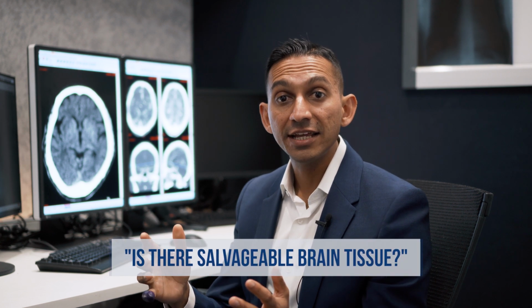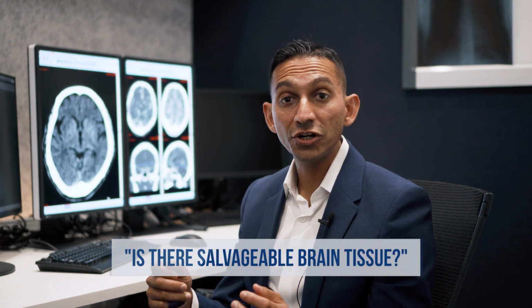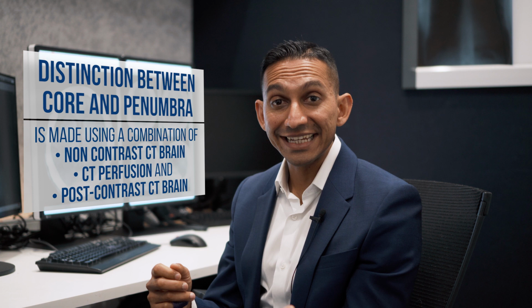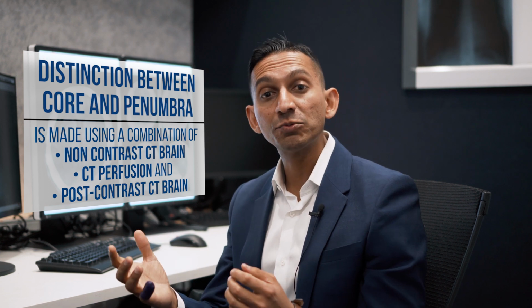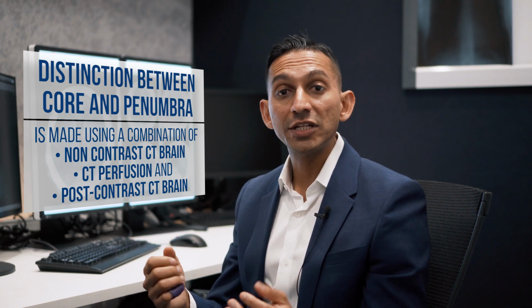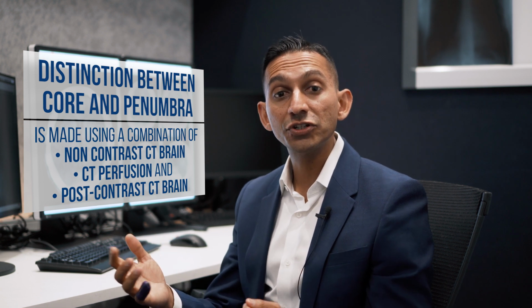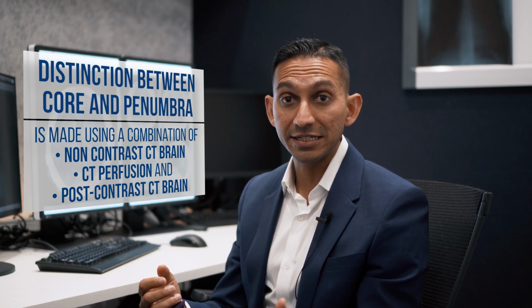Now, an important question to answer is whether there is brain tissue to save. This is because reperfusion therapy such as intravenous thrombolysis or endovascular clot retrieval are targeted at restoring function by saving brain tissue. The distinction between predicted infarcted and salvageable brain tissue is made using a combination of the non-contrast CT, CT perfusion, and post-contrast CT.